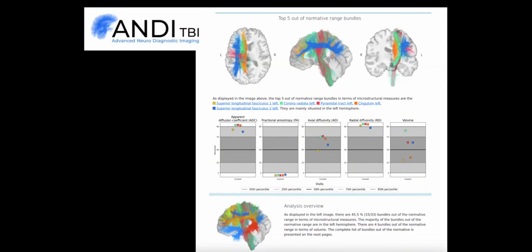Now, if somebody wanted to claim that out of 30 bundles, on a bell curve, maybe like 10% of these might be due completely to chance, then maybe we might only see 3 randomly abnormal white matter bundles in a given individual. But 15, over almost half of the bundles, that's not just due to chance. And so I think that's why it's important to note these abnormalities.